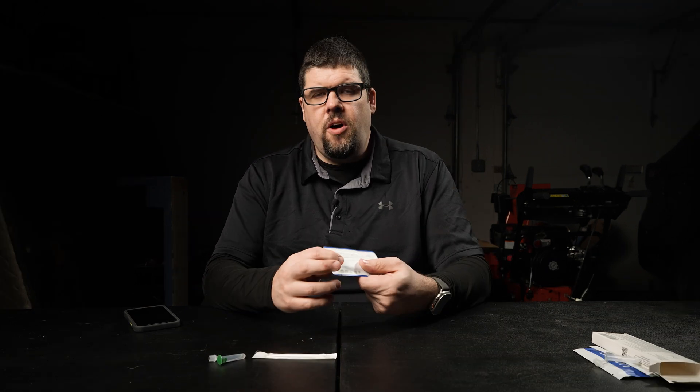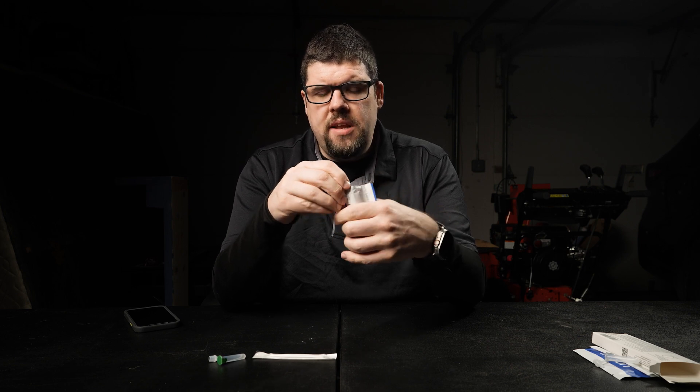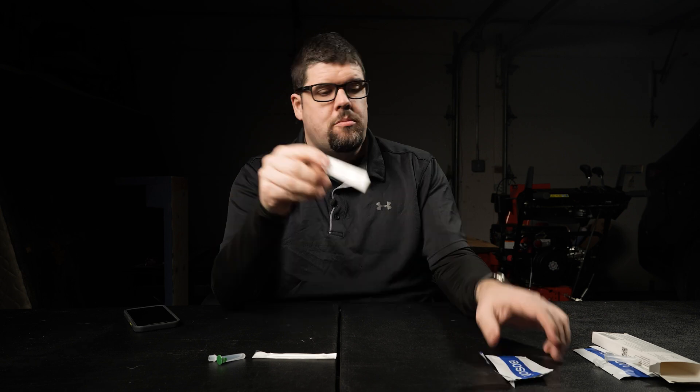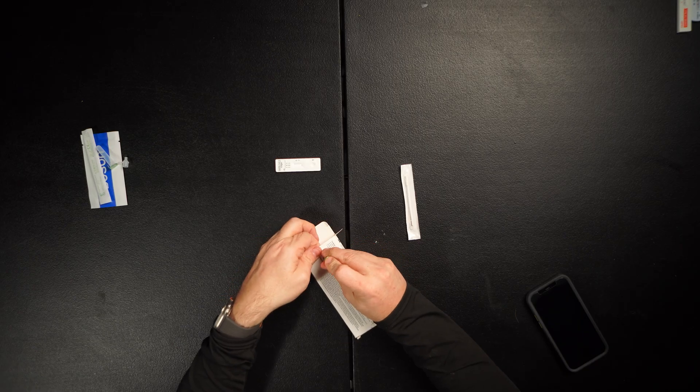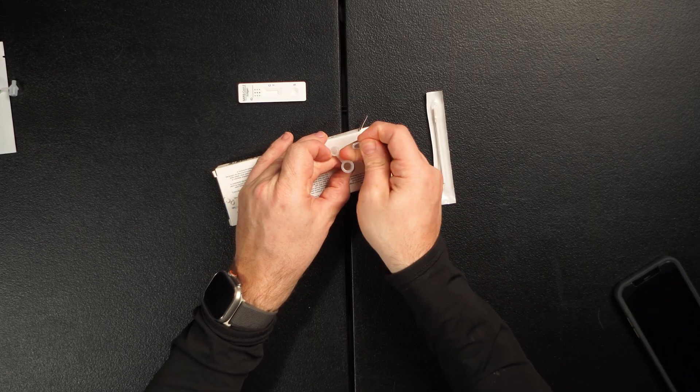This test has some interesting instructions. First of all, this test strip, once you open it, you can't let it sit around for more than 30 minutes — after that it's not going to be guaranteed to work. So I'm going to take this out, put that to the side, take my handy-dandy box, punch this through as a holder, and take off that cover so the liquid is exposed.